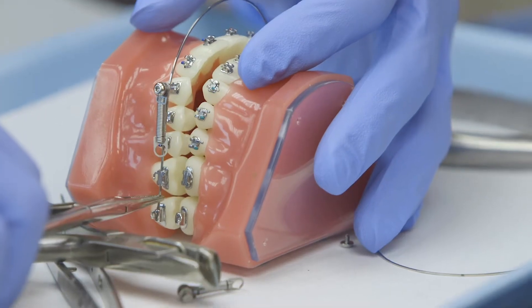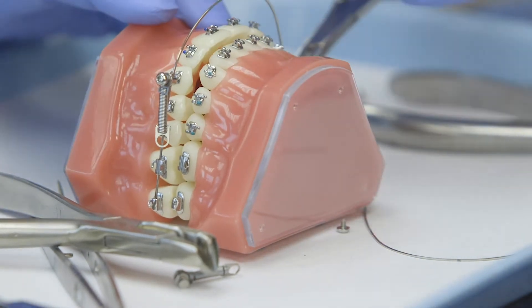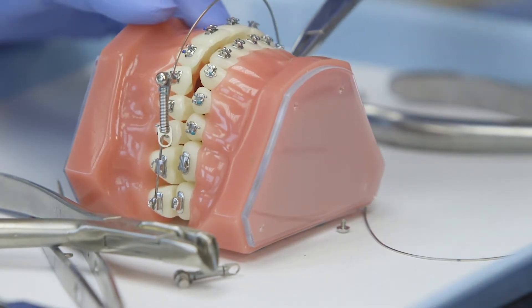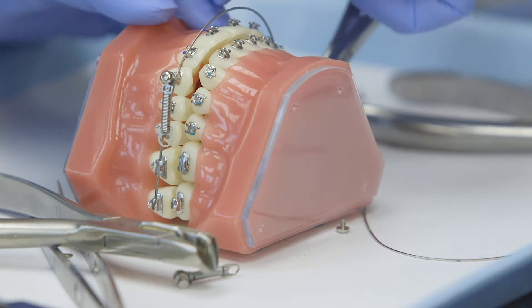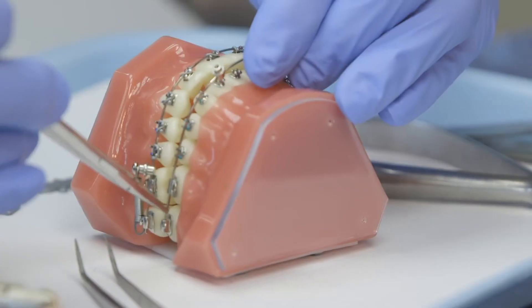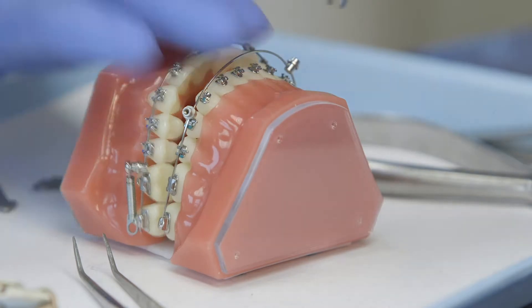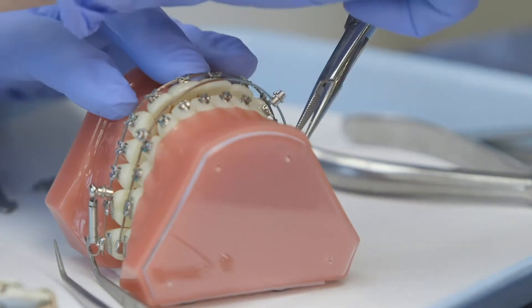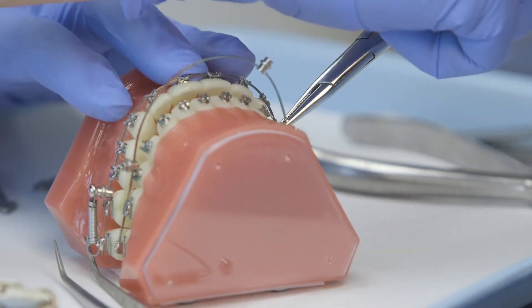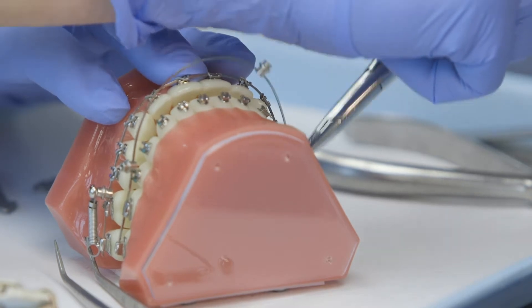At this time, go ahead and insert and ligate the upper arch wire into place, keeping the placement of the pivots mesial to the first molars. Then, for your lower arch wire, slide the pivots onto the arch wire and insert and ligate the wire into place, keeping the placement of the pivots distal to the lower cuspids.